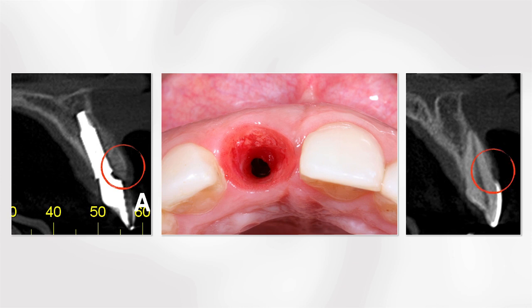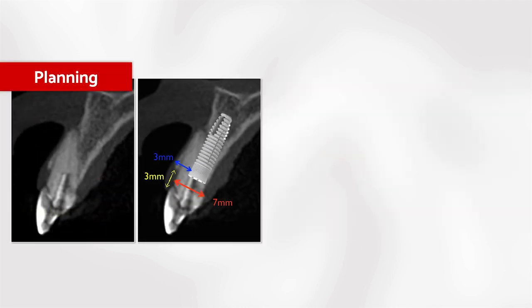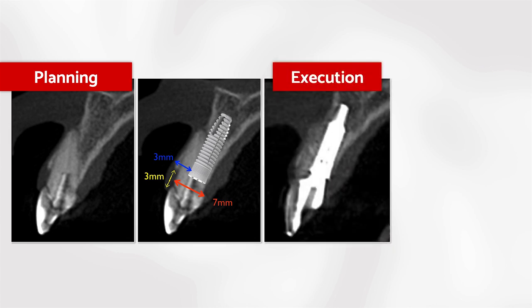Have a look at the thickness of soft tissue. Make a comparison between the right and the left central incisor. And the bone graft is completely remodeled over the implant platform. From our planning to the execution. Remember our planning? And now let's have a look if we did right.